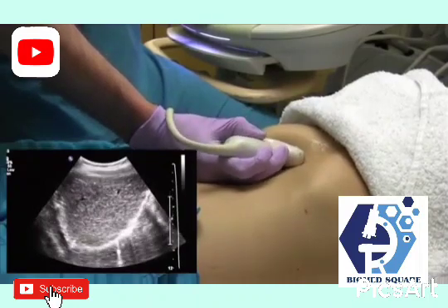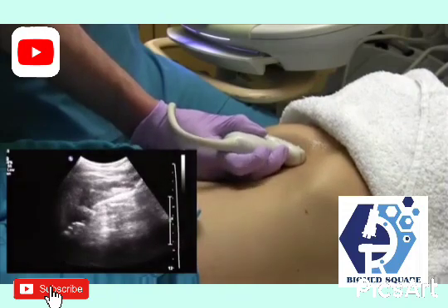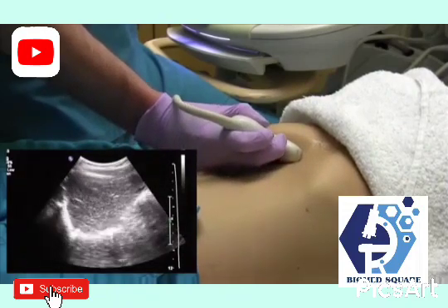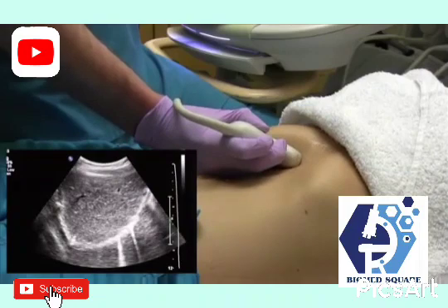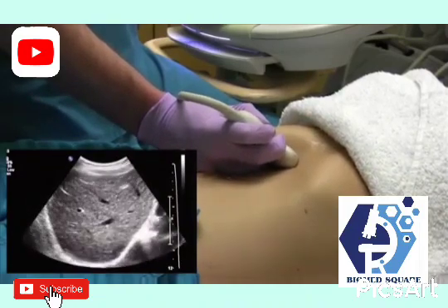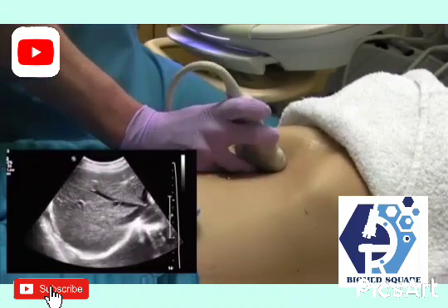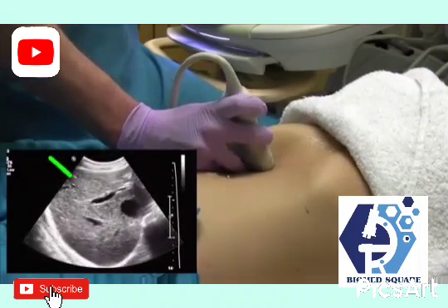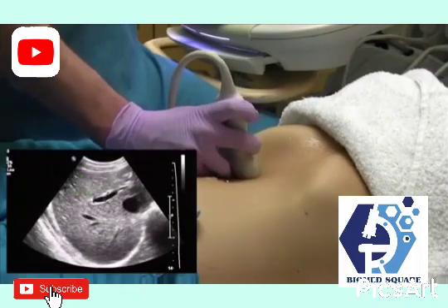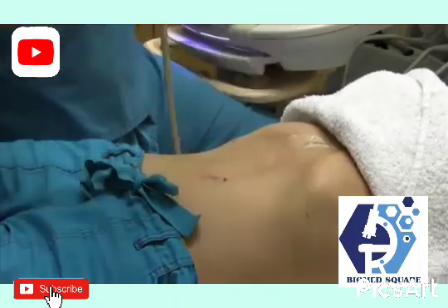So you angle all the way up through the dome of the right lobe and start to come down. You get the parenchyma. Coming down, you'll see the hepatic veins again, and then you'll also come into the portal. And from here, we just sweep all the way out of the liver.